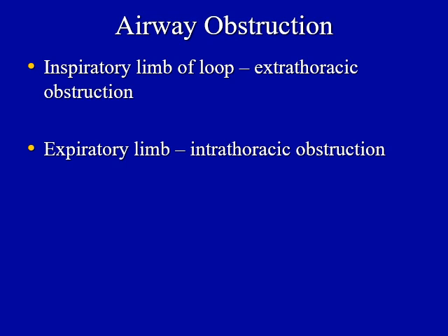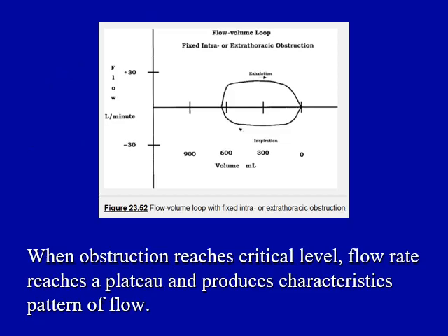Now what happens during expiration? During expiration, the airway pressure becomes positive. So this positive airway pressure maintains the patency of the trachea. The opposite occurs in case of intrathoracic obstruction. So I will show in the next slide how it will be.